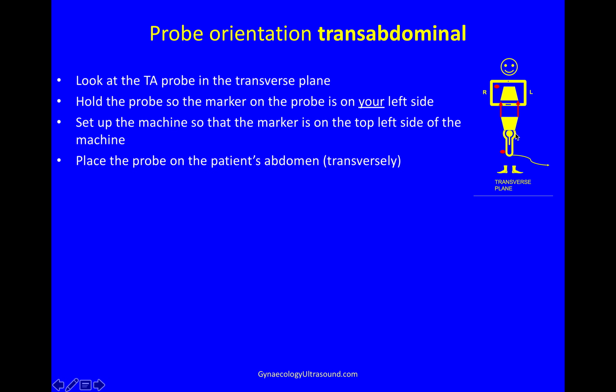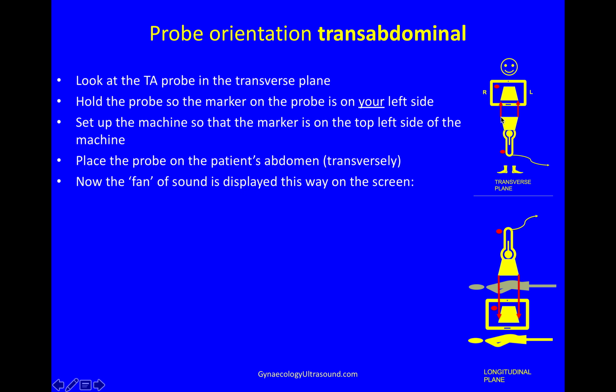Then in this orientation, transversely, you put the probe on the patient's abdomen, and the fan of sound that comes out of this grey strip is displayed that way, so that everything from this side goes to this side, everything from here goes to there.